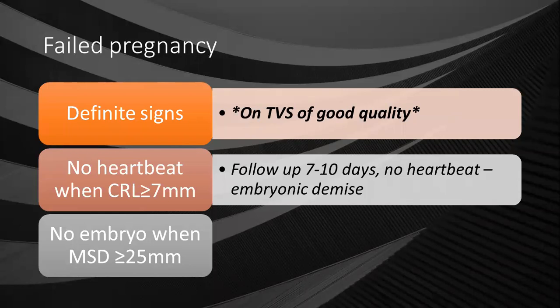For some reason, I don't know why, I kept on scanning. Then I turned on color Doppler again. Then at that point, there came just a flash of color signal, and then it would disappear. Came a flash again, disappeared, and at that point I was now confused. So what does this mean? Is there a positive heartbeat here or what? Where is this flash coming from? Is it just coming from the sweep of the probe or what?